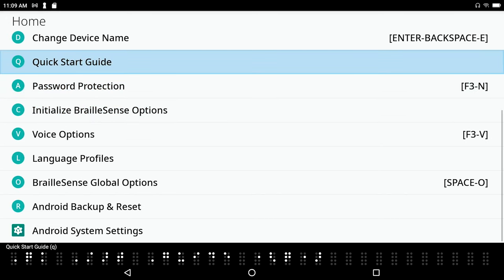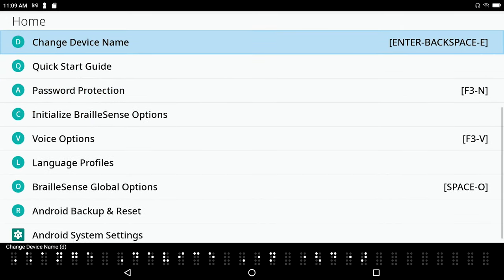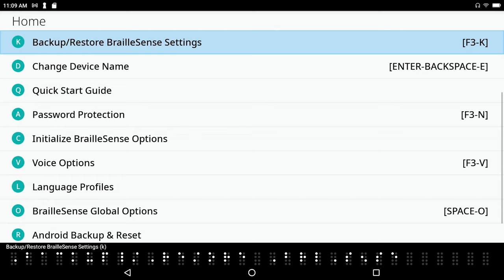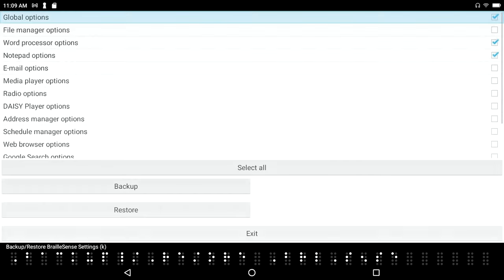Initialize Braille Sense options C, password protection A, quick start guide Q, change device name D, backup restore Braille Sense settings K. And I hear that the hotkey is the letter K, so I could have just pressed the letter K and got into this menu.